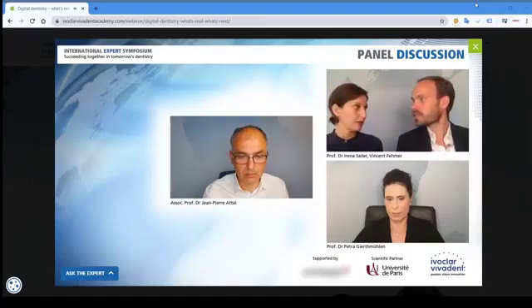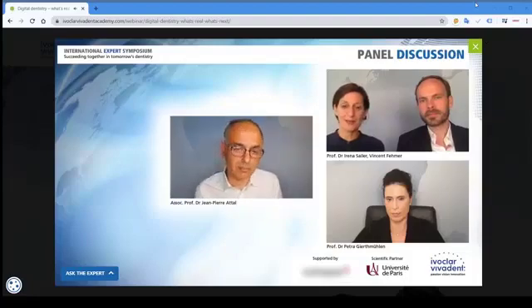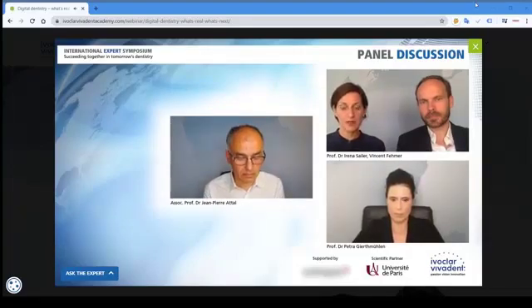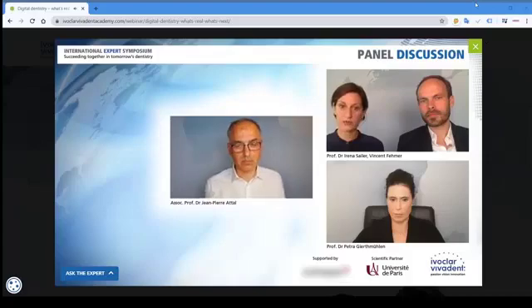For the biologic complications, it's a little bit more, I would say, complex, because we have a lot of literature showing that excess cements, specifically resin cements, can cause biologic problems around the implants and implant restorations. This new type of restoration, the monolithic abutment crown cemented to titanium base, is not evaluated yet, so we don't know if this specific resin cement close to the bone level will have problems over time or not.